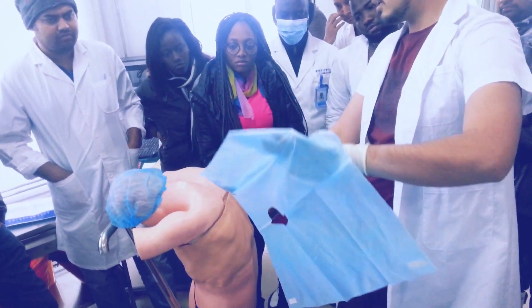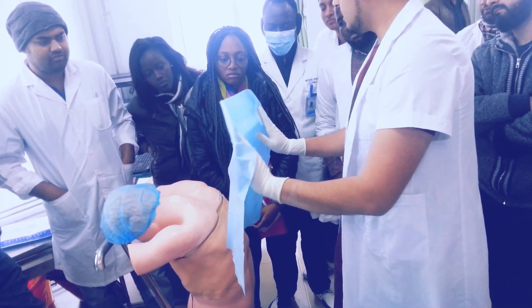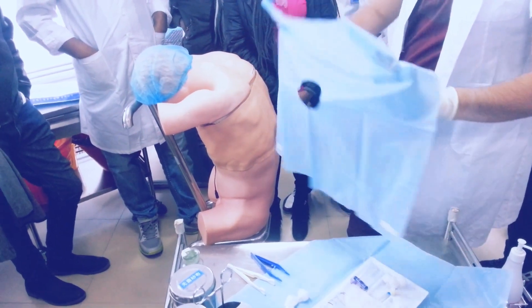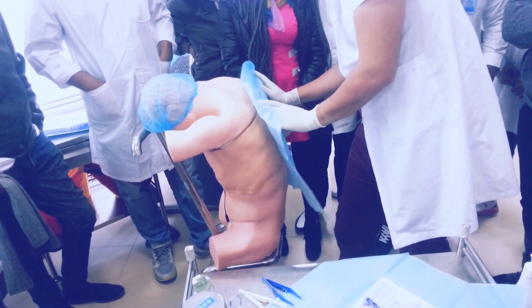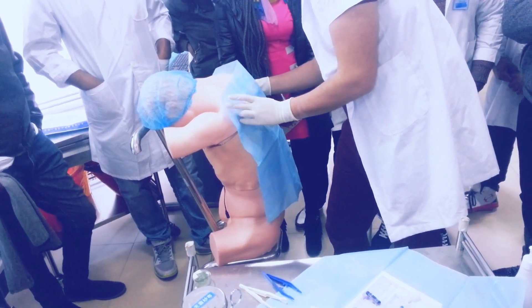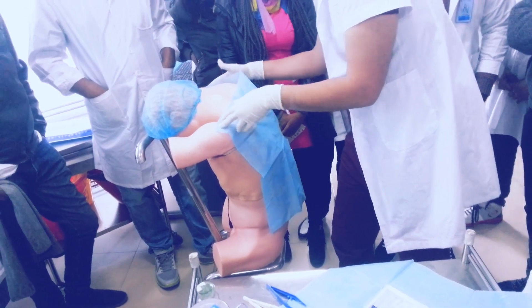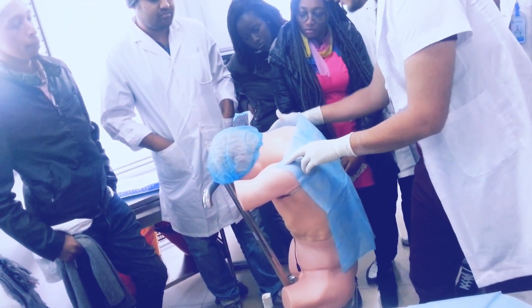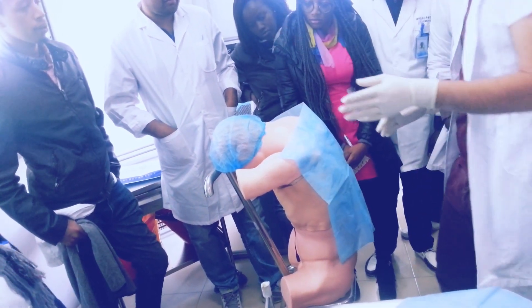So this is how you pick it up — see, my hands are not on the other side; they are on this side. So when I am putting this on the patient, I will not touch the patient with my sterile hands. The glove part should not touch the patient.